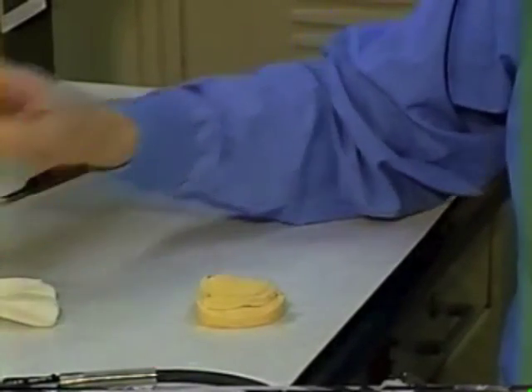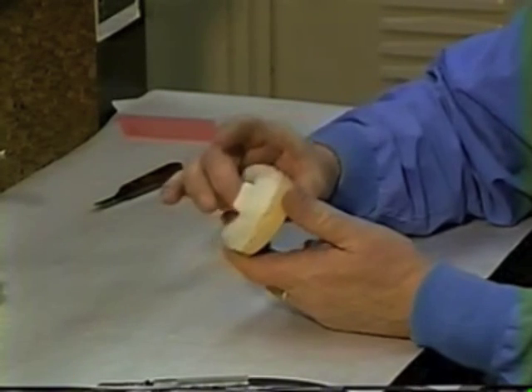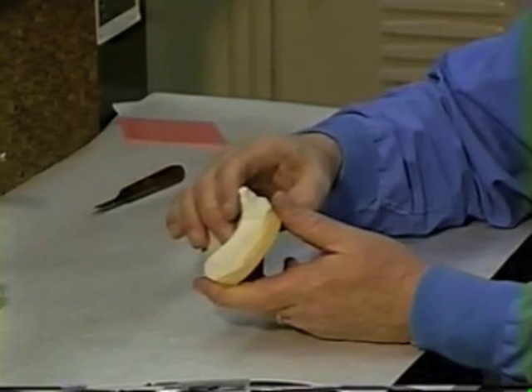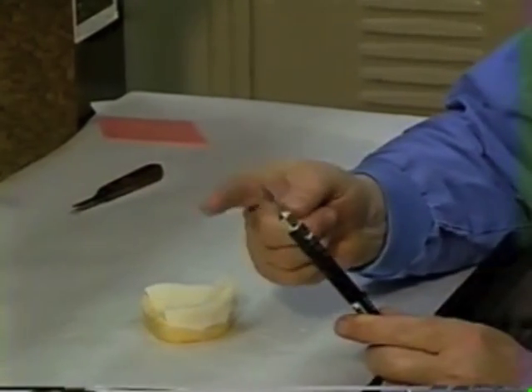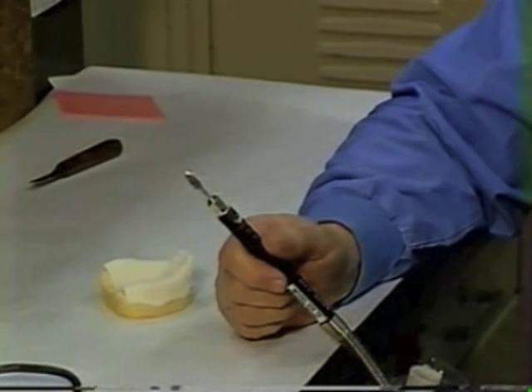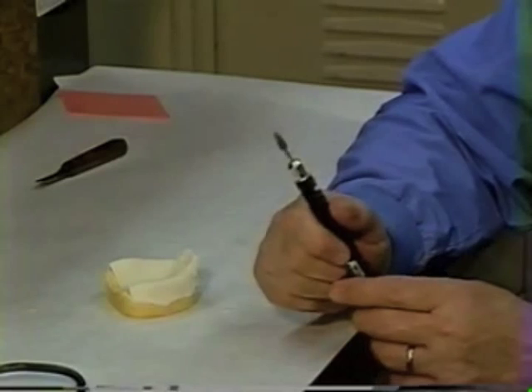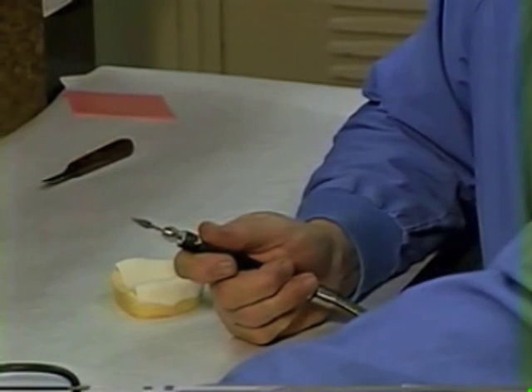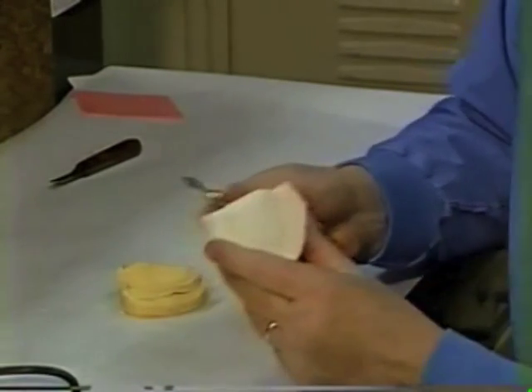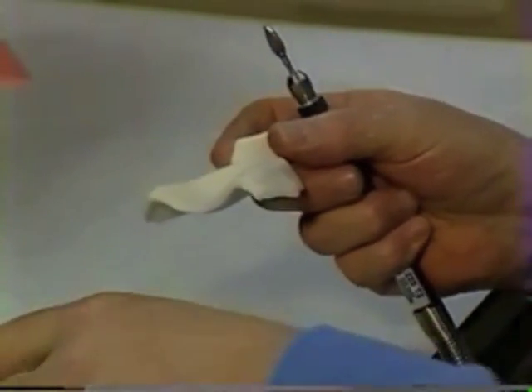Use the trays to make them fit the cast and get them back to the line — as you can see, they're too long because we purposely made them that way. Now we're going to trim them back to the lines we originally drew. You can use a slow speed handpiece with an acrylic burr, a lathe with an arbor band, or a Dremel tool with a large burr — all essentially the same. Get the Dremel tool going and trim the rough spots off, fitting the tray back to the cast to see you're approximately at the original line.